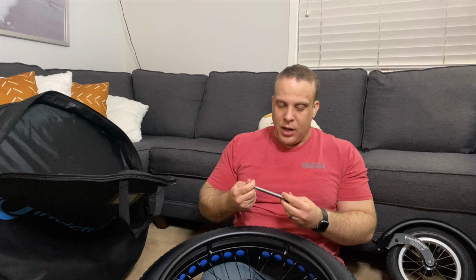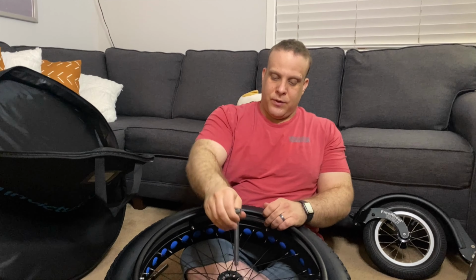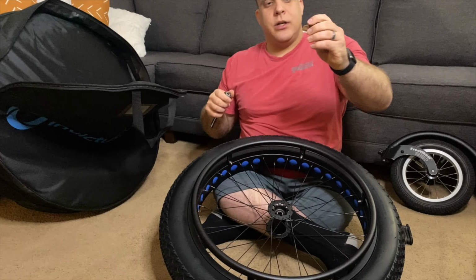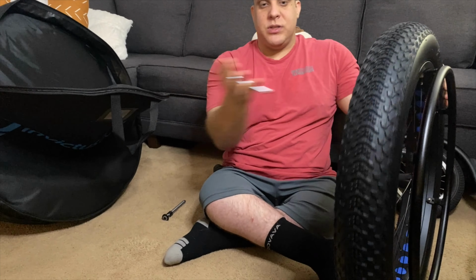So a couple of things: these are extra long axles to fit through here, because the wheel's a little bit wider. And additionally, it came with these plastic spacers. When I put these on my chair, it will allow the wheel to have a little more space away from the chair so that there's enough clearance and I don't get rubbing on the sides. So give me a minute here, I'll get my chair into place and then we'll show you how they go on the chair.